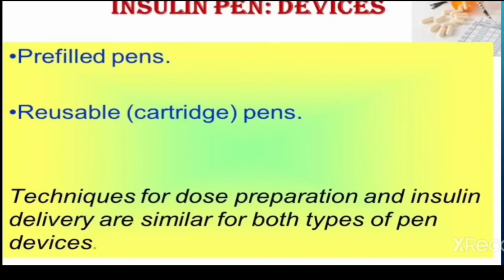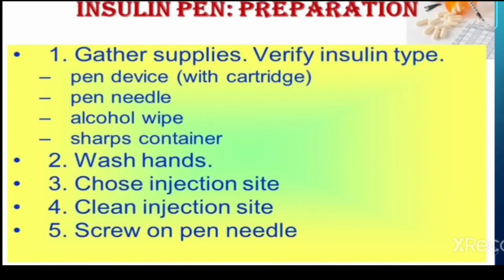Insulin pen devices: pre-filled pens and reusable pens. Techniques for dose preparation and insulin delivery are similar for both types of pen devices. Insulin pen preparation: gather the insulin, pen devices, pen needles, alcohol wipes and sharps container. Then wash the hands, choose the injection site, clean the injection site and screw on the pen needle.